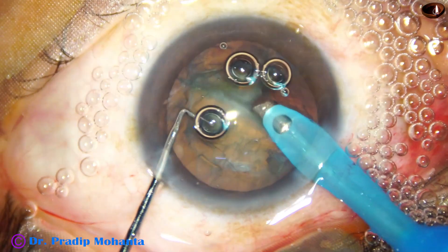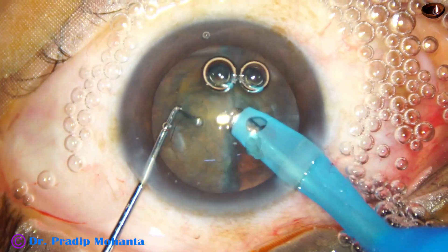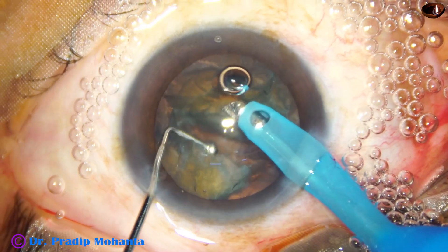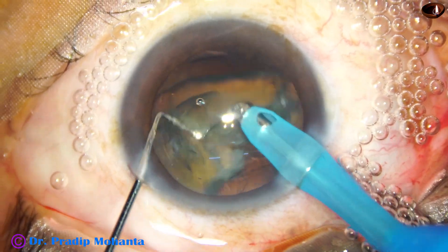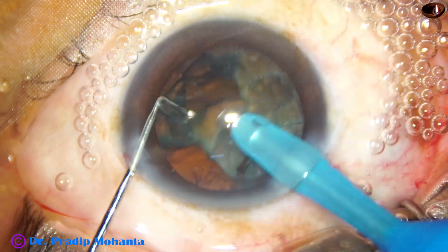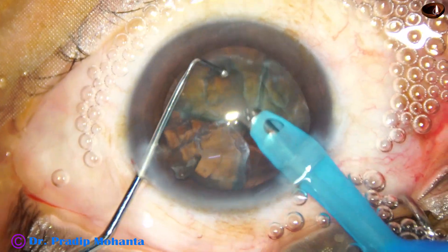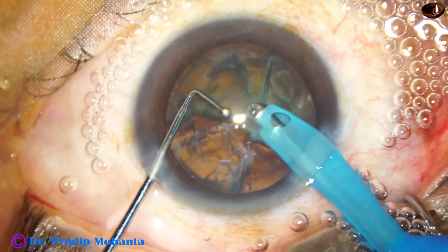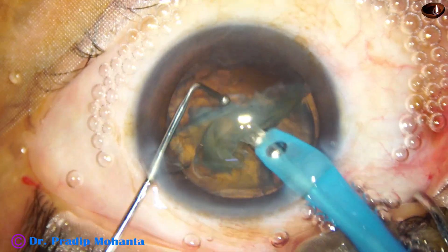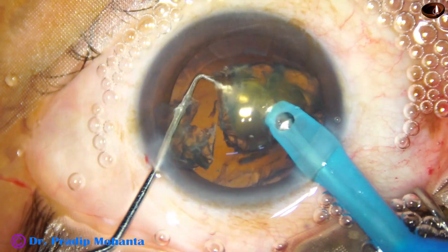And then we get the other fragment. The other fragment didn't come — we are going to divide the other hemi-nucleus. The pieces are coming; yes, two more fragments are still there. These two pieces are not completely separated yet. Now it is separate. And finally the last piece comes.